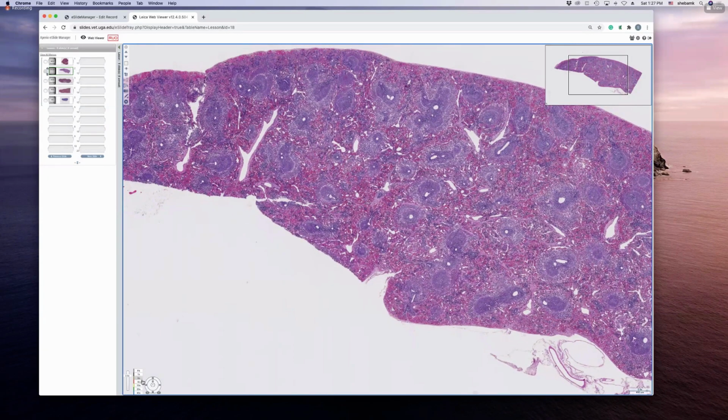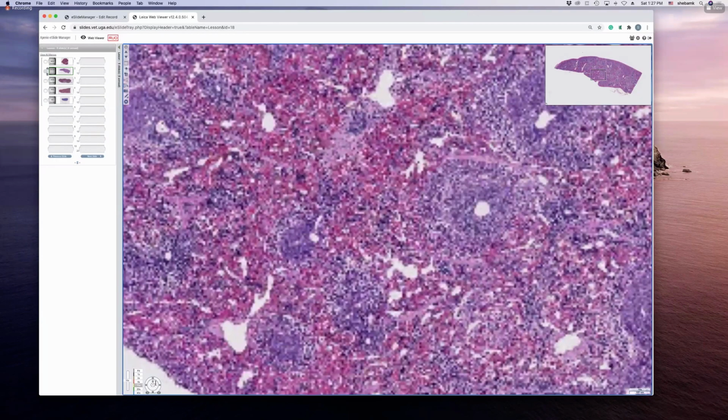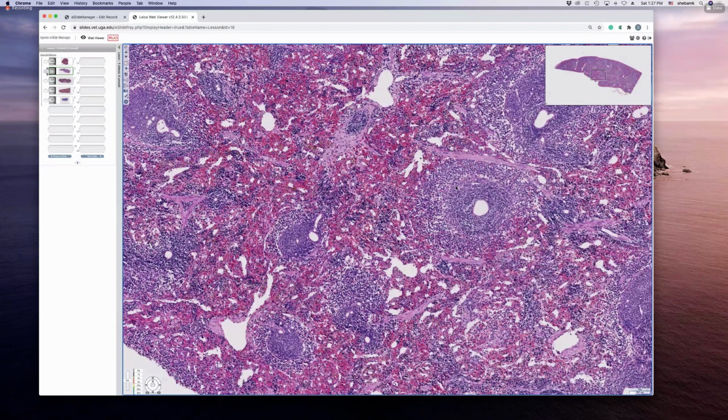So if you look at the spleen closely, we have two distinct zones, right? What are they? The red pulp and the white pulp. Exactly. So the red pulp is here, and the white pulp is all this blue stuff, which in real life will look white.